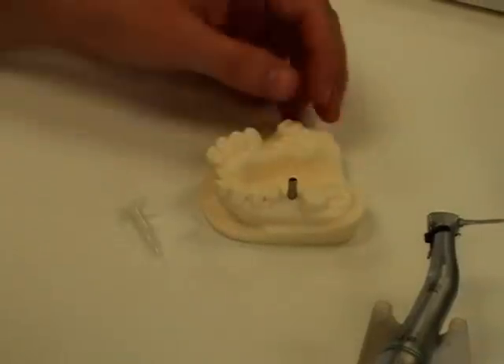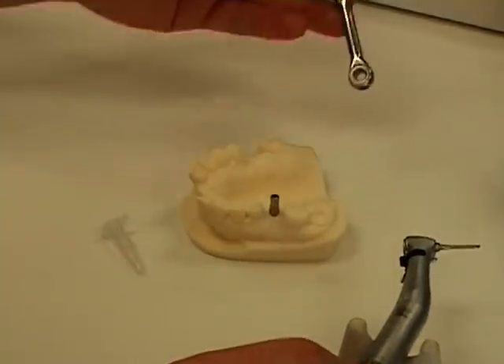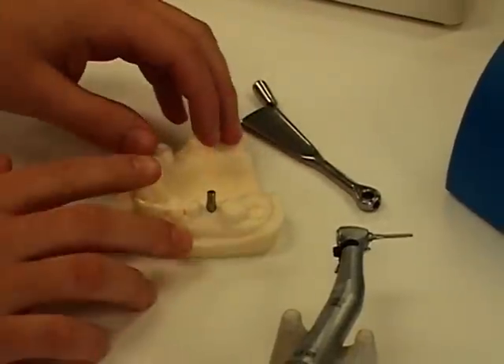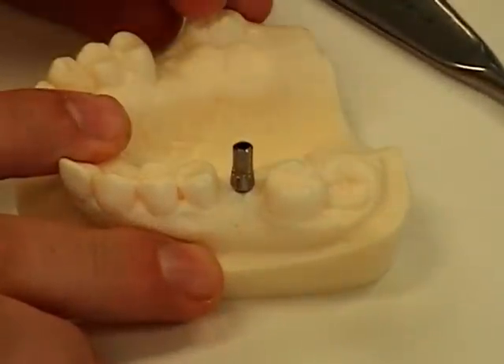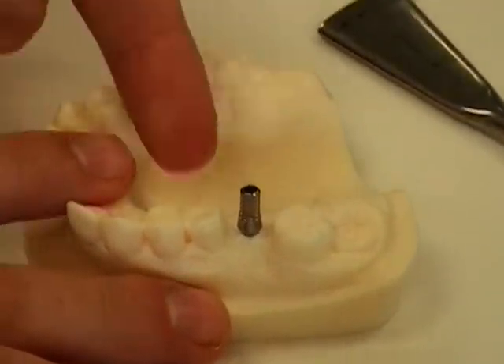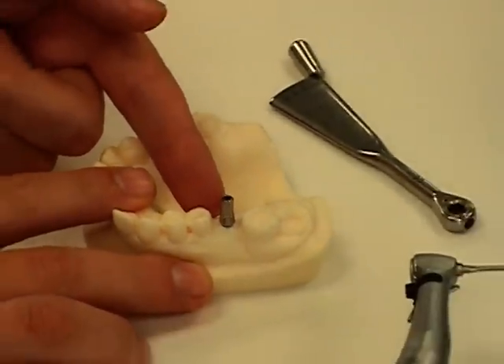The importance of using a torque control device, whether it be a handpiece or a torque wrench, is two-fold. First, you do not want to leave the screw too loose, which could result in the abutment loosening itself and coming out of the patient's mouth. Also, you do not want to over-tighten it, which could damage the screw, the abutment, or possibly the implant, which could lead to further problems.